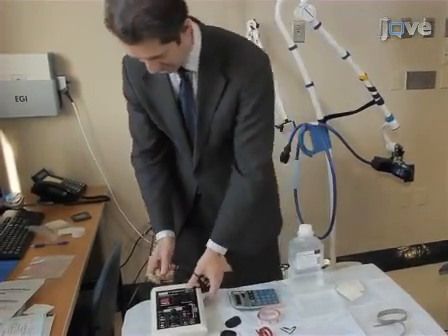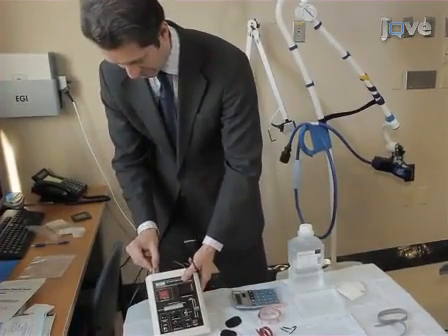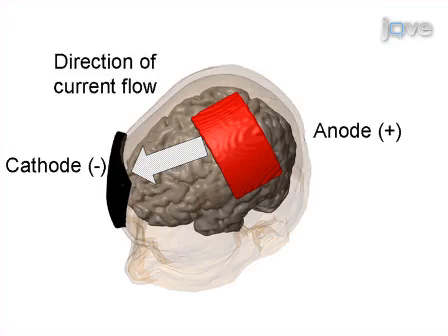Ensure the connection polarity is correct, as the effects of TDCS are highly polarity specific. This is critical, since in the context of TDCS and electrical stimulation in general, the anode is the positive terminal where positive current flows into the body, while the cathode is the negative terminal where the positive current exits the body.